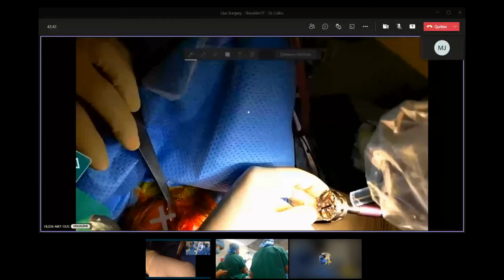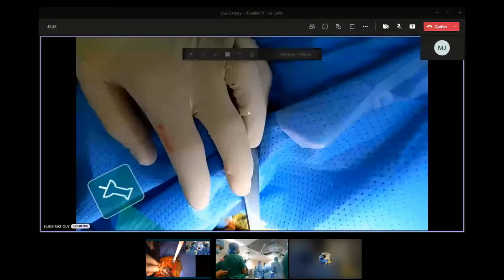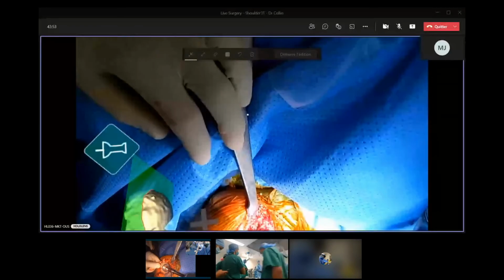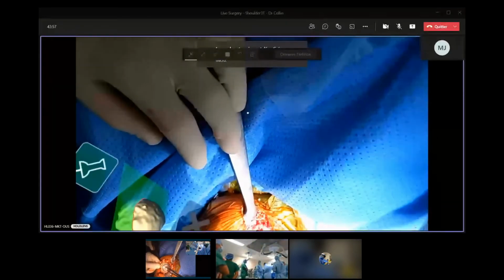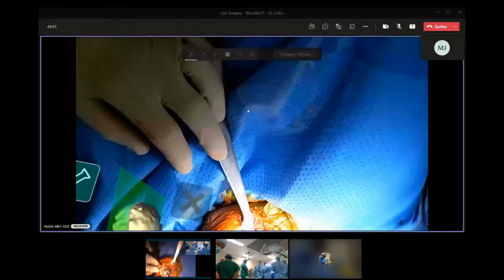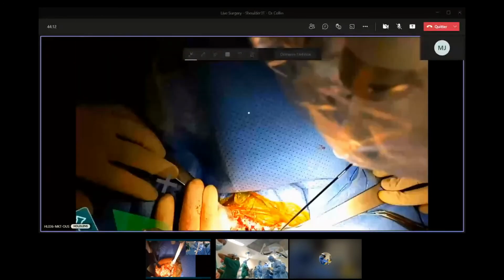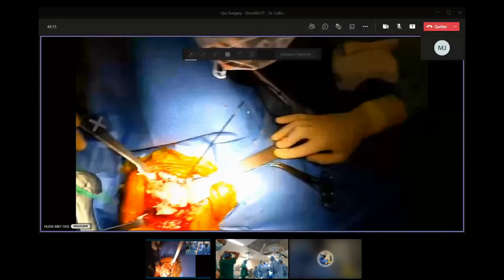Elle n'est pas tout à fait la même. So it's not exactly the same device as at home.